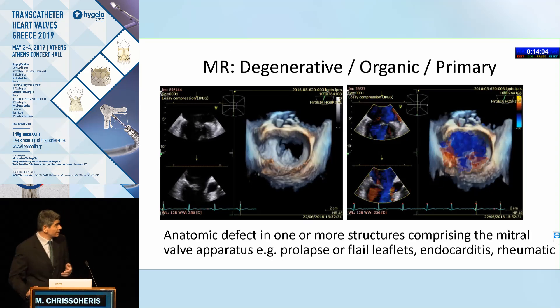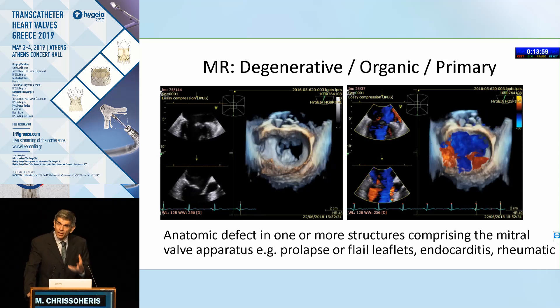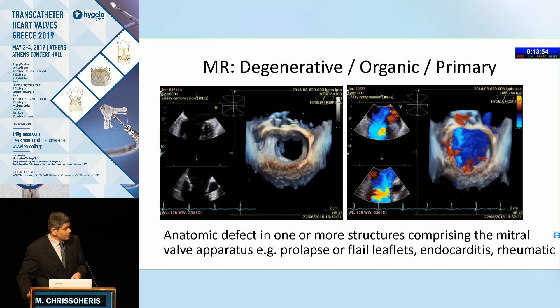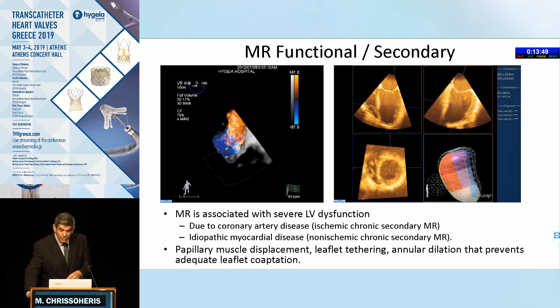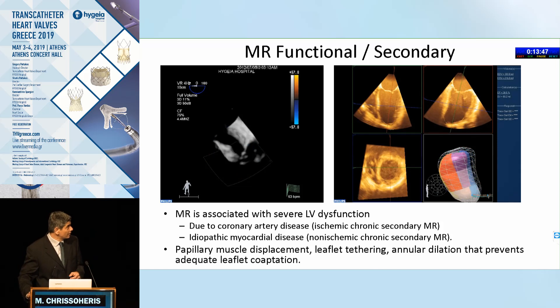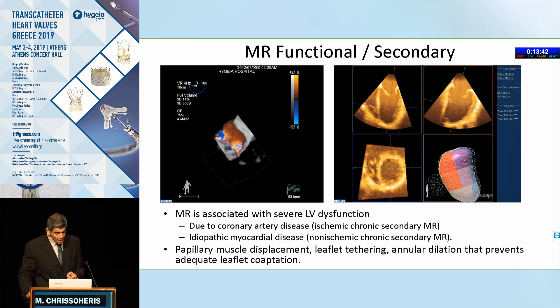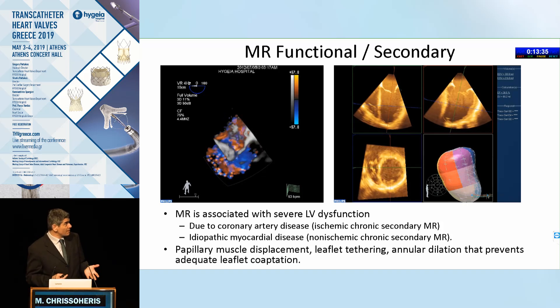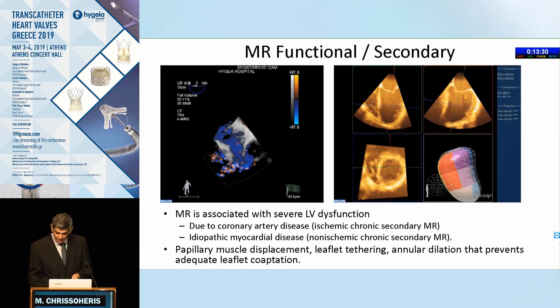Regarding degenerative, organic, or primary MR — however you want to call it — the defect is primarily on the leaflets or the mitral valve apparatus, as in this case a P2 prolapse with severe regurgitation. On the other hand, severe functional ischemic or secondary MR is primarily due to LV dysfunction caused by coronary artery disease or idiopathic reasons, with displacement of the papillary muscles, tethering of the leaflets, and annular dilatation leading to abnormal coaptation.